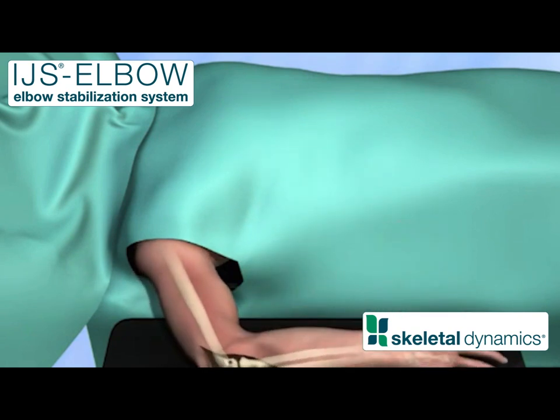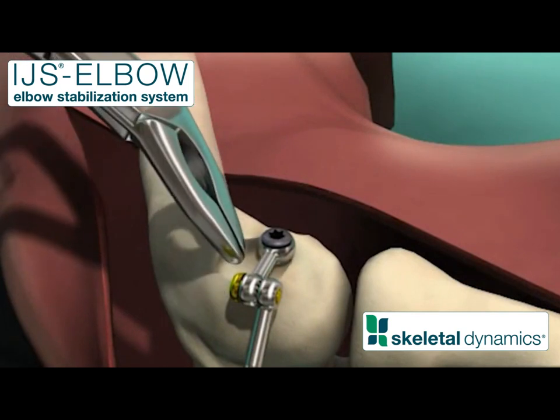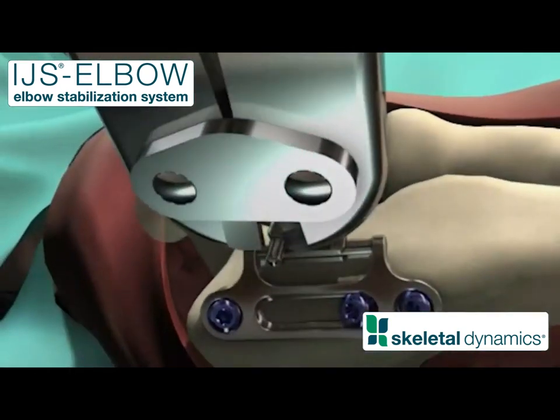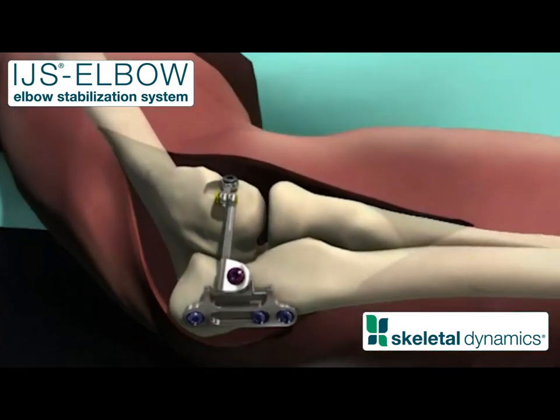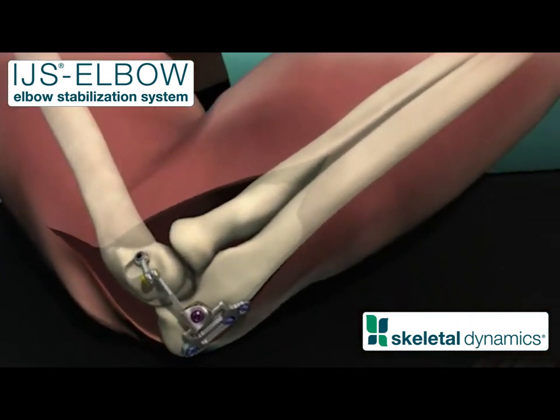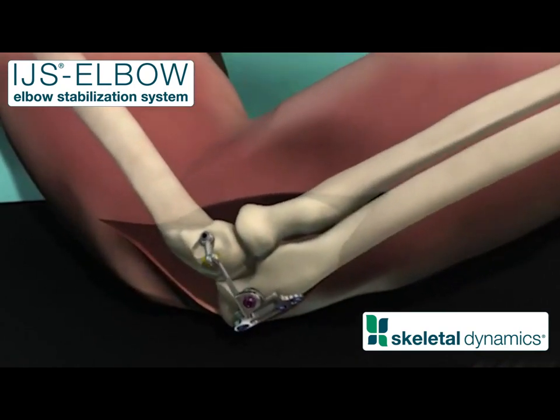Remove any bone on the lateral epicondyle that interferes with the free rotation of the boom. Use a pin cutter to remove any excess length from the connecting rod. Verify the patient's range of motion one final time.